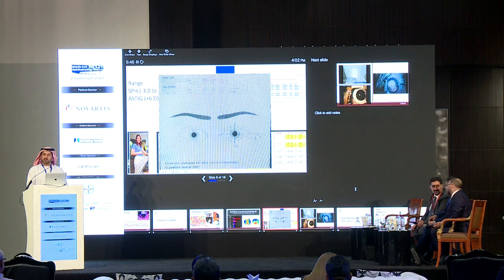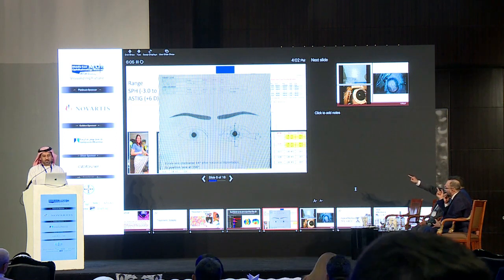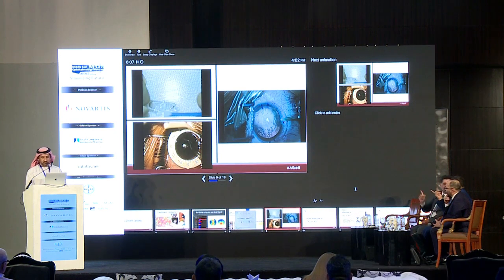And then the plan comes as such. We all know that a rotation of 1 degree can result in 3% reduction in your cylinder. So a 33-degree rotation will negate everything you've done. And again, you need to utilize a very good alignment for those surgeries.